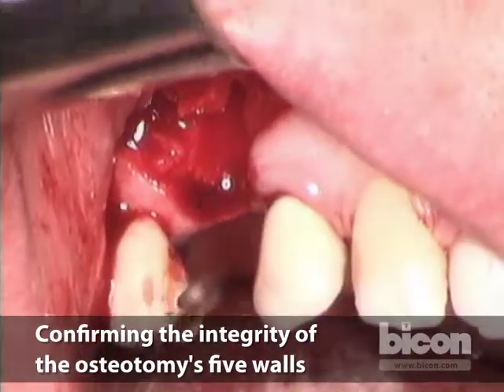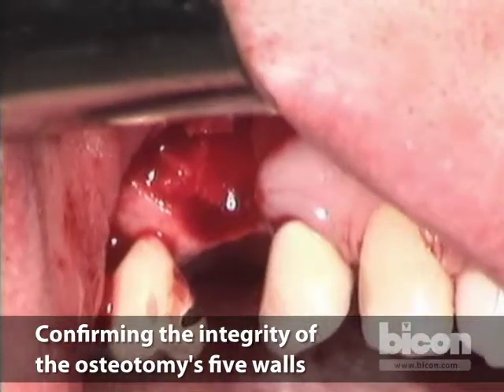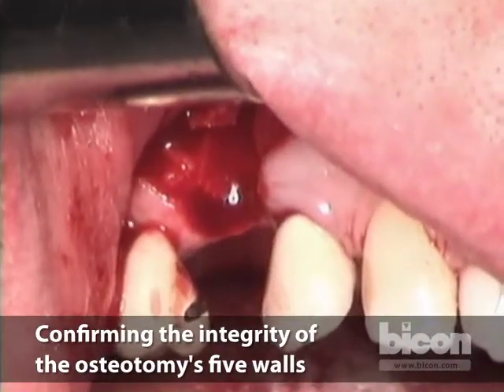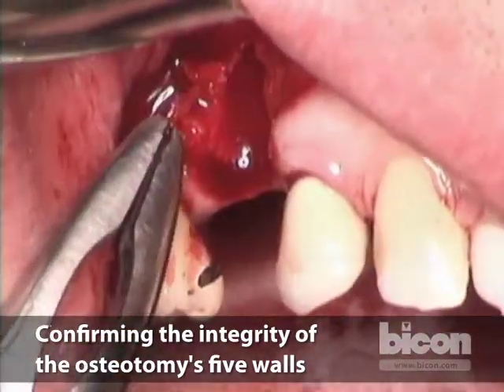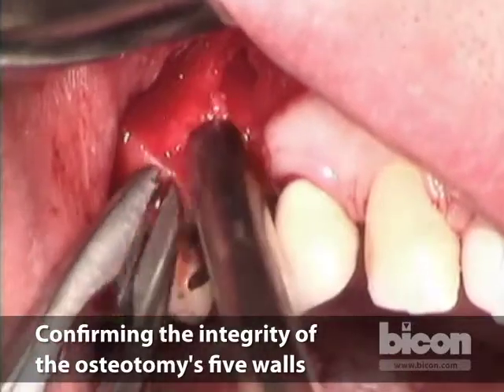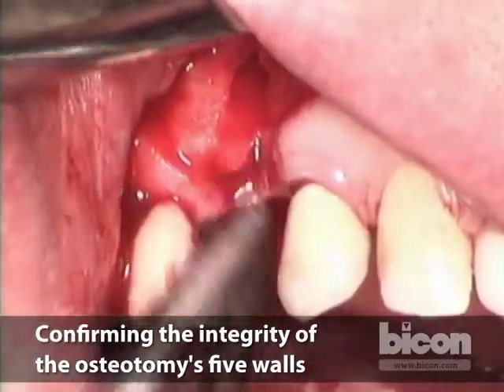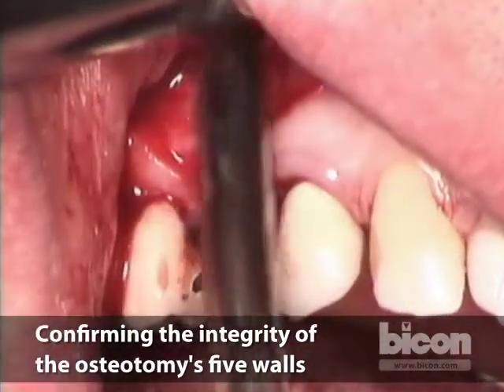Let me have a rongeur. I don't want this bone. Soft tissue rongeur will help us clean up the little loose pieces of bone. No, I don't want to make a suction. And we have enough bone that I don't want to have these. You can take that off. I want to make sure that the whole area is nice and clean.